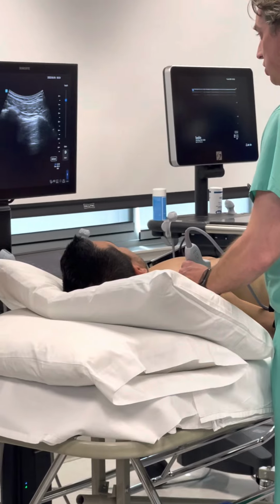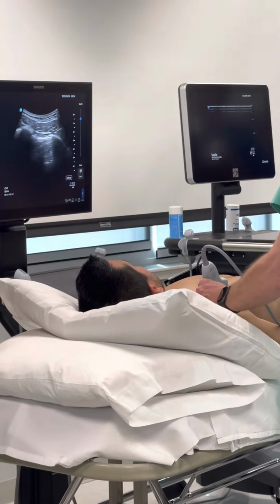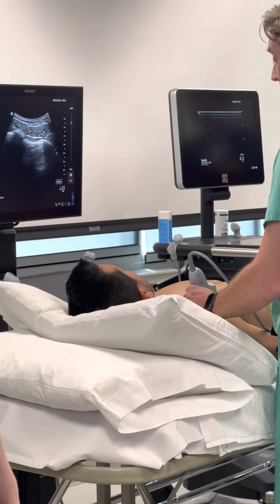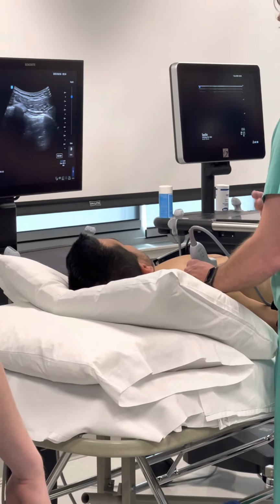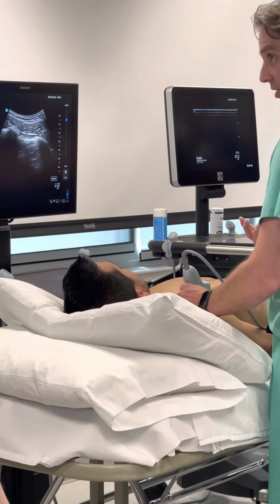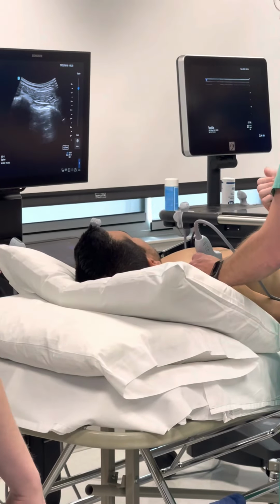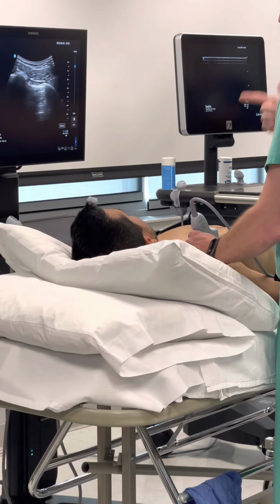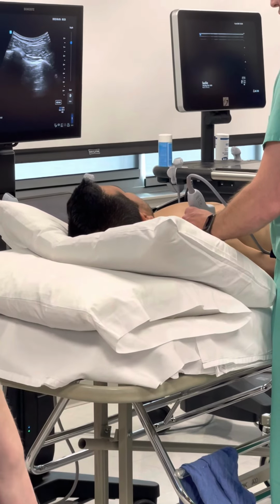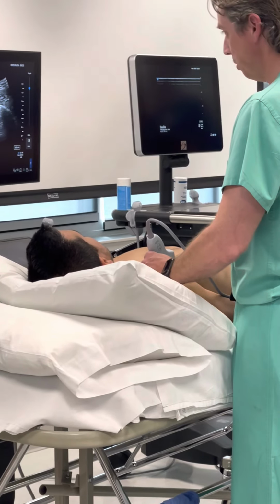Now, if he had a lot of consolidation, you'd see big B lines that come down here, right? And those big B lines indicate that there's either more fluid or solid structures in there. Does that necessarily diagnose whether you have an interstitial pneumonia, or is it a heart failure fluid? It doesn't differentiate that, but you can say, all right, I know I have lung there, so I know I don't have a pneumo, and it doesn't look normal, but it looks congested of some sort, right? So you have some sort of pulmonary congestion in there. Could it be just a bunch of mucus from a pneumonia? Absolutely, it could be.